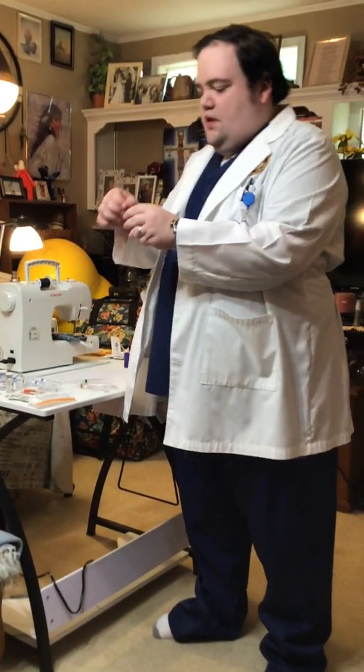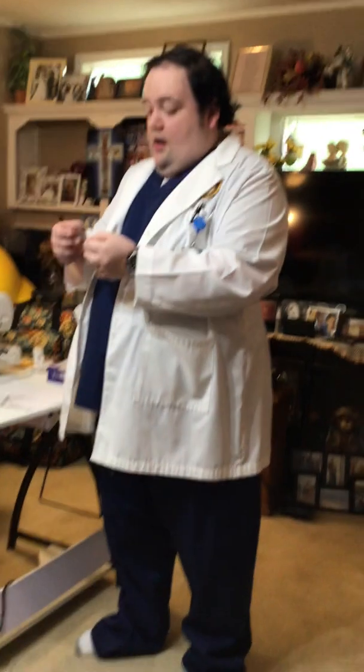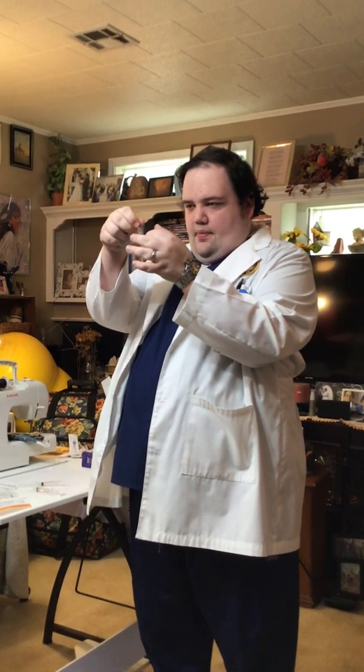Now, when I go to get the medication out of the ampule, I've already tapped it, all of the liquid is at the bottom. I'm going to take an alcohol swab. Now you see, if you're not paying attention, you'll get the liquid back at the top. You have to flick it back again. Always correct your own mistakes.